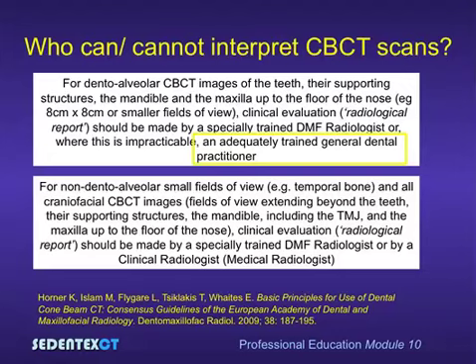That for dentoalveolar cone beam CT images of the teeth, their supporting structures, the mandible and the maxilla up to the floor of nose, for example 8 by 8 centimeter volumes or smaller fields of view, clinical evaluation should be made by a specially trained dentomaxillofacial radiologist or, where this is impracticable, an adequately trained general dental practitioner.